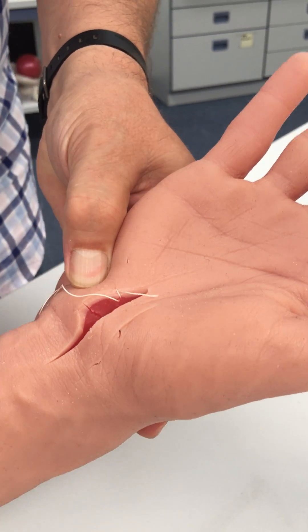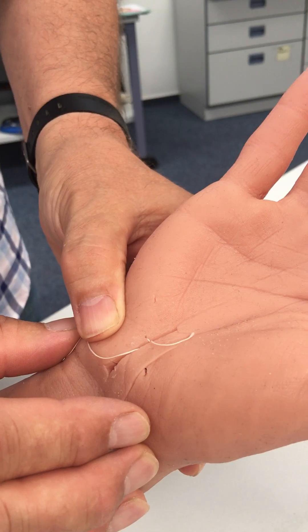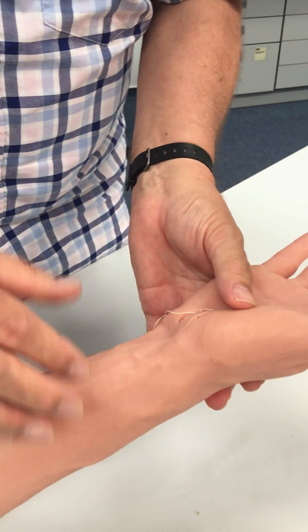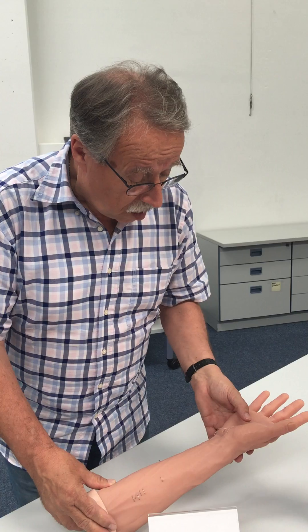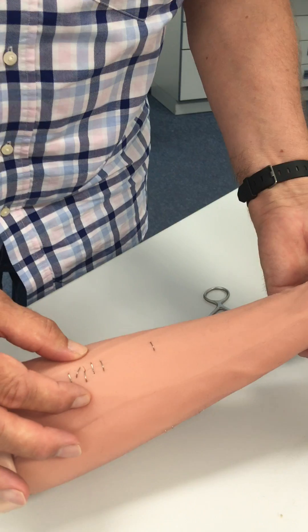So you can train first to suture the muscles and then to suture the skin. It can be classically sutured with a needle, or it can be done as well with medical staples.